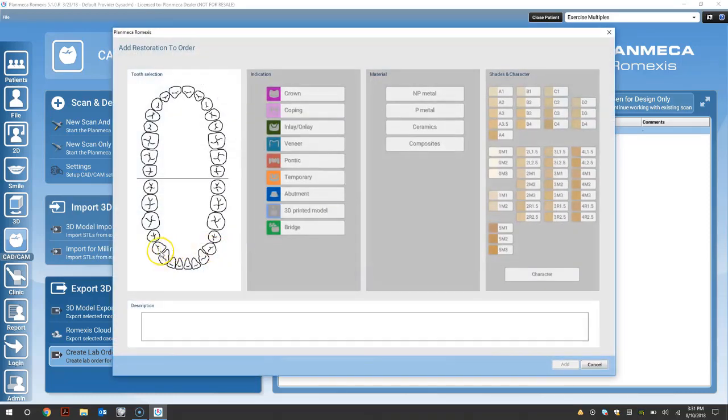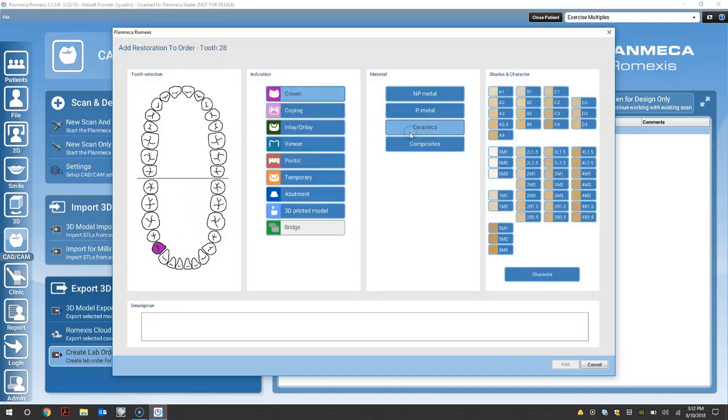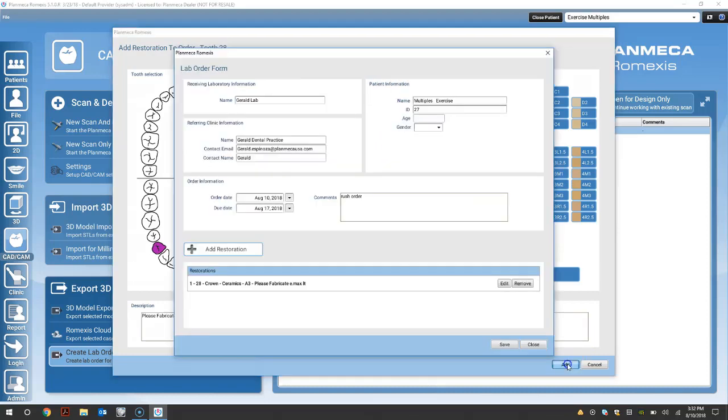And add restoration. Select your tooth number. Select the indication. Select the material and select your shade. Next, go ahead and add your description for your case.